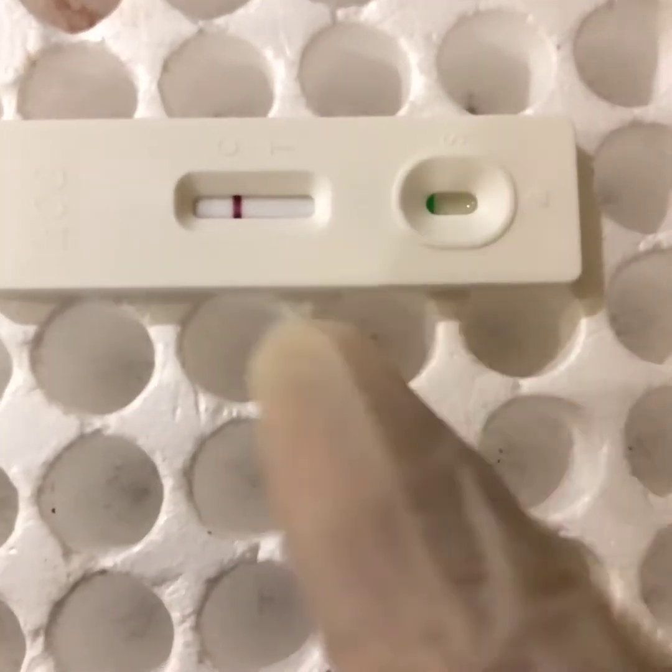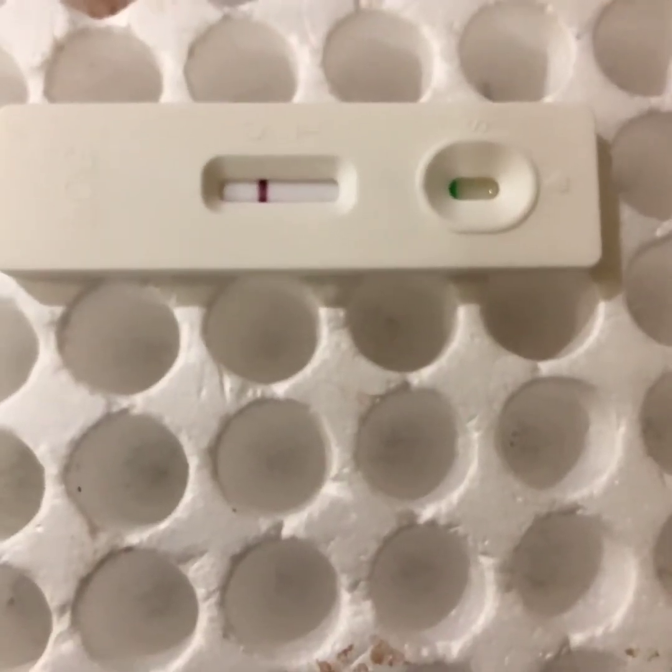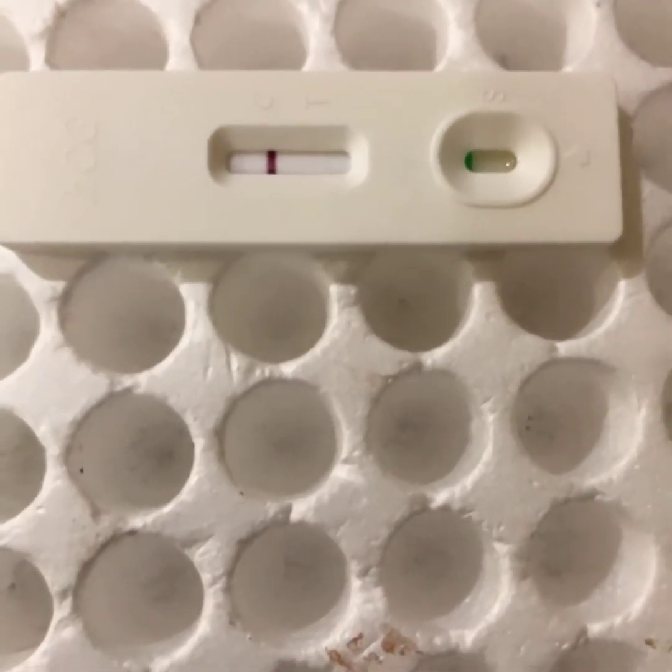There is no line here, so our interpretation for this one will be considered a negative test result.